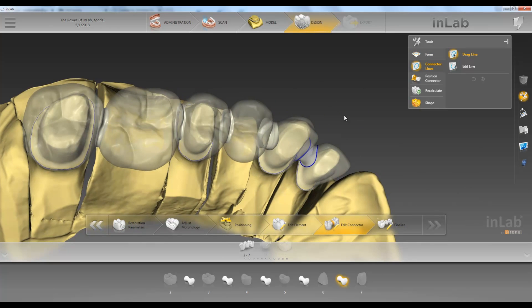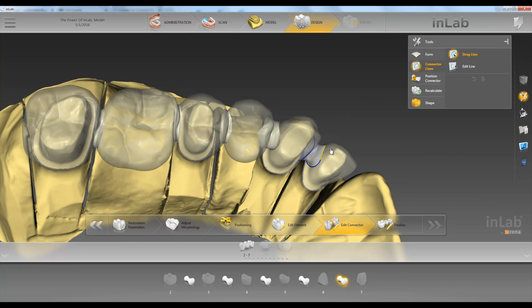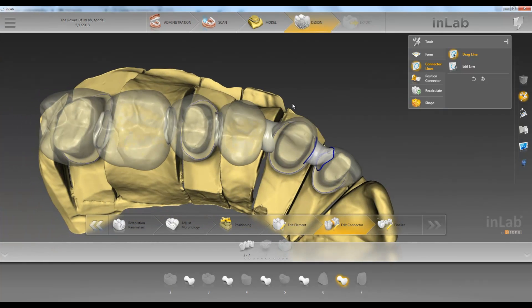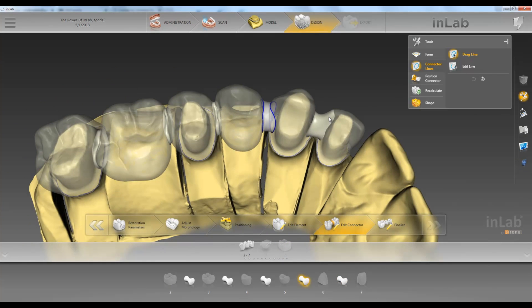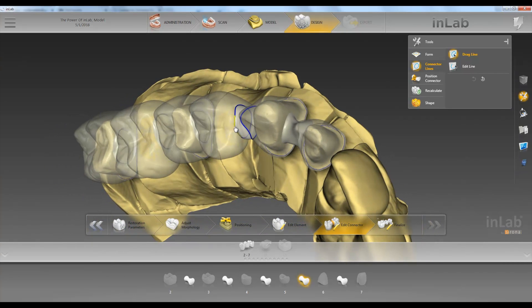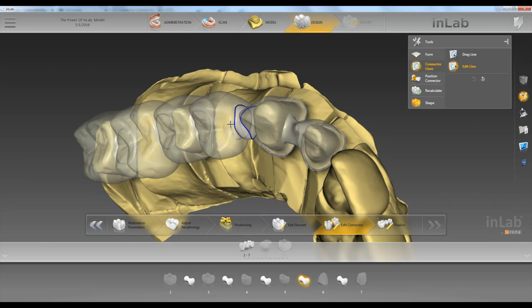So let's say we want this connector to be higher. You can see it pulled it up there. Or if we don't want to pull it, we can edit it and just go ahead and draw where we want our connector to be.